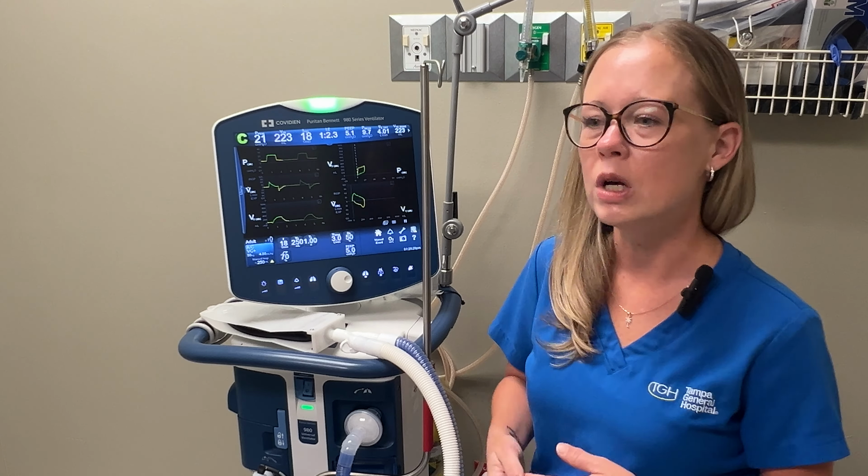We have our peak pressure, our tidal volume, our rate, our inspiratory to expiratory ratio, our PEEP, our mean airway pressure, our minute ventilation. Those are all of the things that the patient is doing. So you can look here and figure out what they're doing differently from the settings that we have set for them.